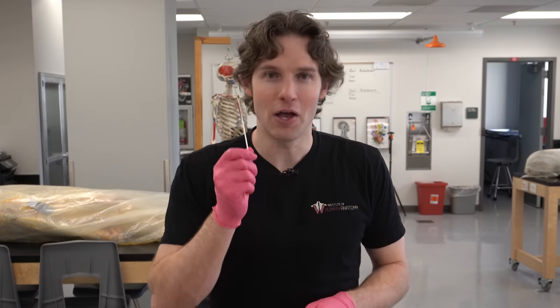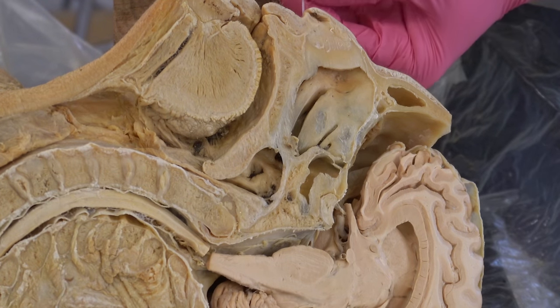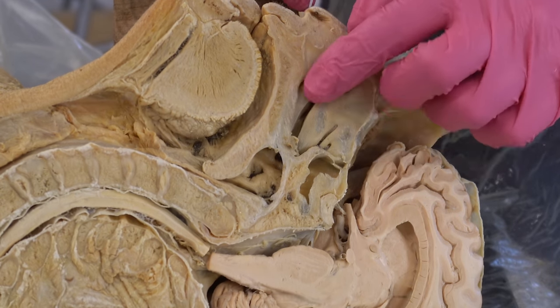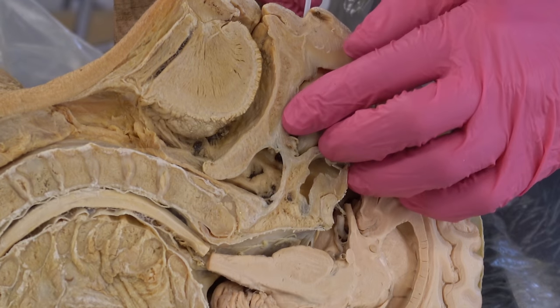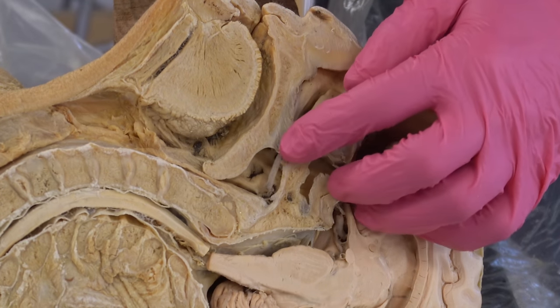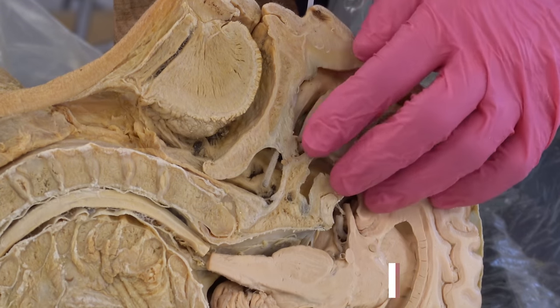Now that I am equipped with the nasopharyngeal swab, we can proceed with the procedure. We're going to go through the right nostril, through the right side of the nasal cavity, and advance posteriorly — not up, posteriorly. You can see it kind of pushing through the septum there; we'll help direct it because this septum has a hole, which is not normal. And now we're all the way back to the nasopharynx, where they often even recommend giving a little twist — which Justin's going to be really excited about.